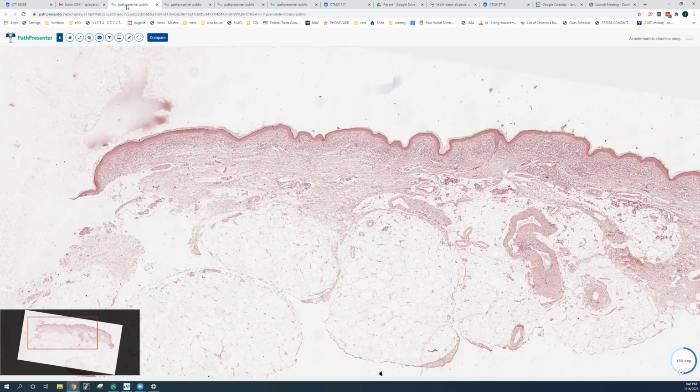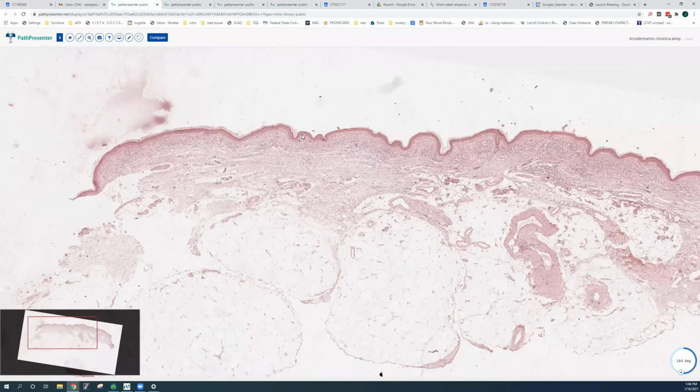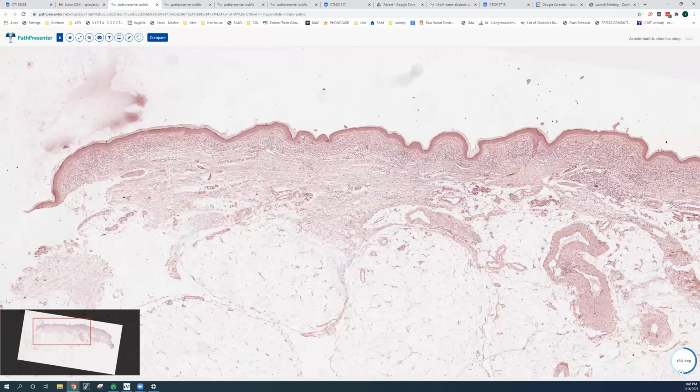Again, ACA is associated with the European species of Borrelia, specifically Borrelia afzelii. Patients have high levels of IgG antibodies, and the organism can be identified by PCR in the skin biopsy. So here we have a biopsy of ACA, not specific, but characteristic features of ACA in this biopsy.